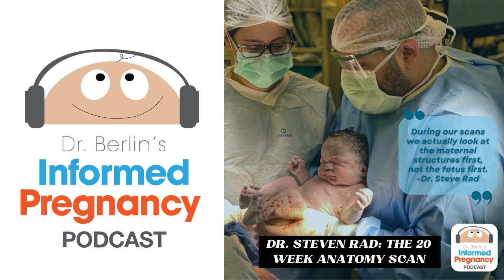And then from the head and brain, we move down to the face. In the face, we're not just looking to make sure the baby looks cute. We're looking at the orbits or the eye sockets. We're looking at the lenses of the eye, looking at the nose and nostrils. We're looking at the nose and lips and the palate, make sure there's no cleft lip or palate. Looking at the profile and making sure that there's no abnormalities in the forehead or the actual nose and lips, and that entire structure, making sure that it's symmetric. And then looking at the chin, and then we might get a cute 3D at that point.